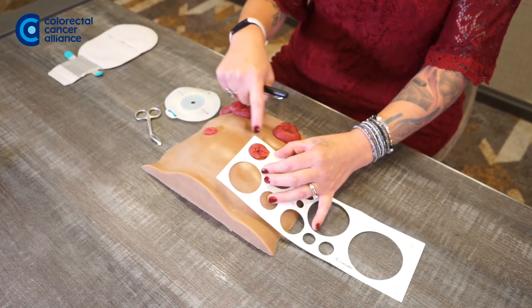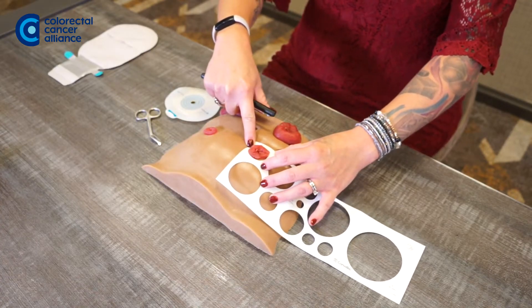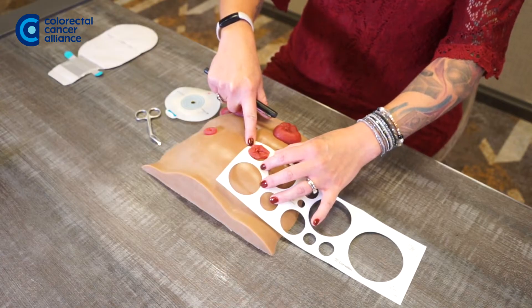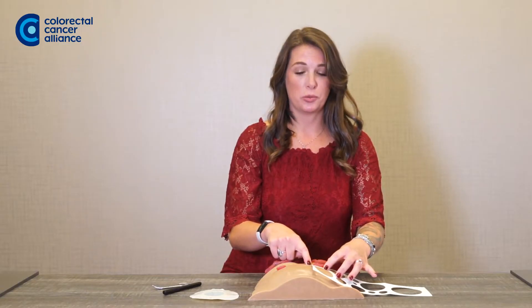This stoma right here is a colostomy. If you see there is a little bit of room around the stoma, you do want to leave about an eighth of an inch, because your stoma will contract and extend. So you want to make sure that you're giving it extra room.